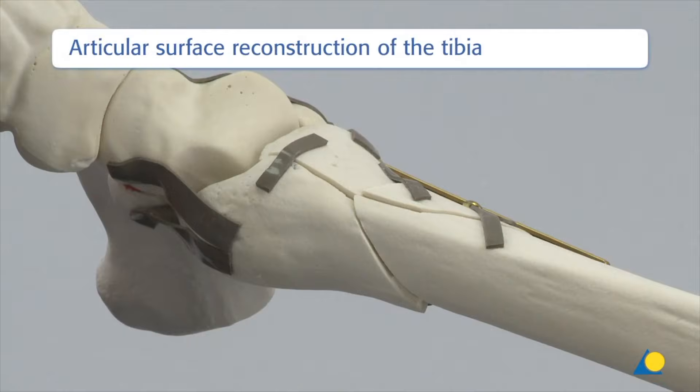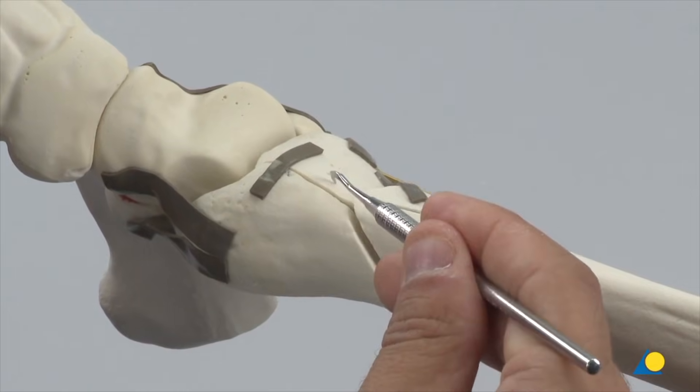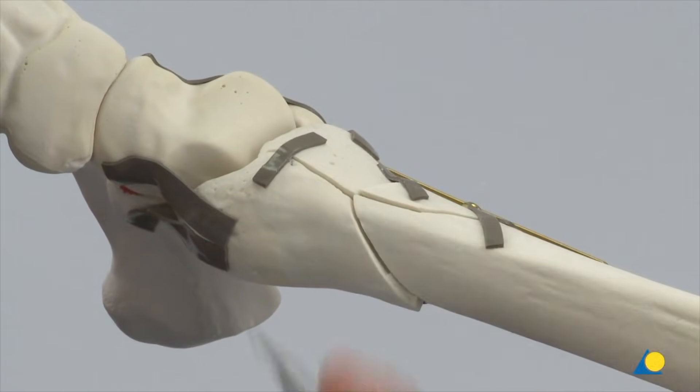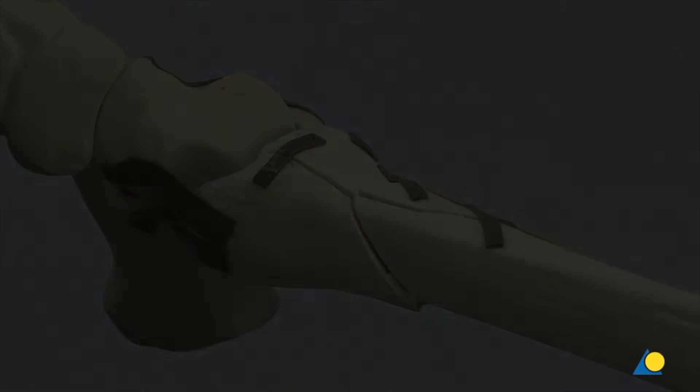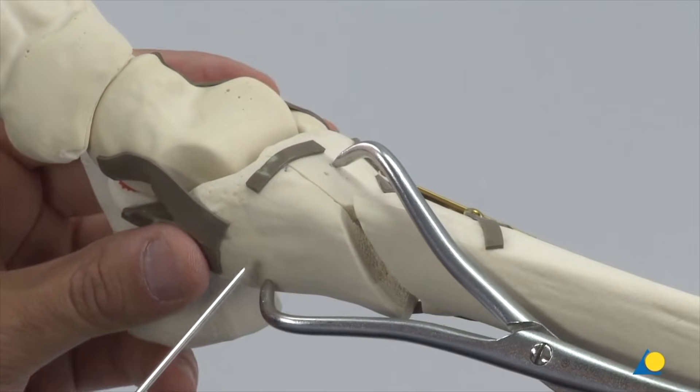At this stage, the bone is repositioned in the clamp. After exposing the distal tibia and ankle joint through an anteromedial incision, the articular surface is inspected. The large anterolateral fragment is anatomically reduced and held in place with the large pointed reduction forceps and a K wire.